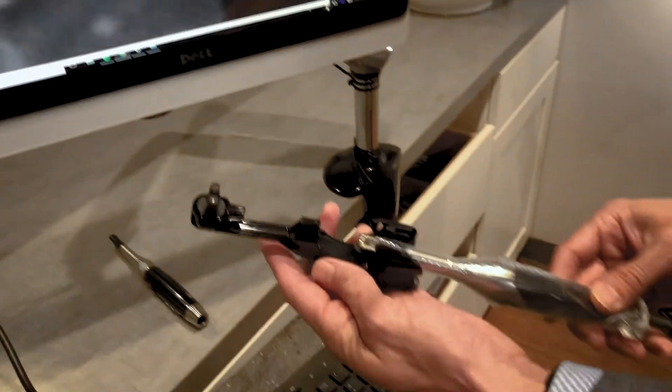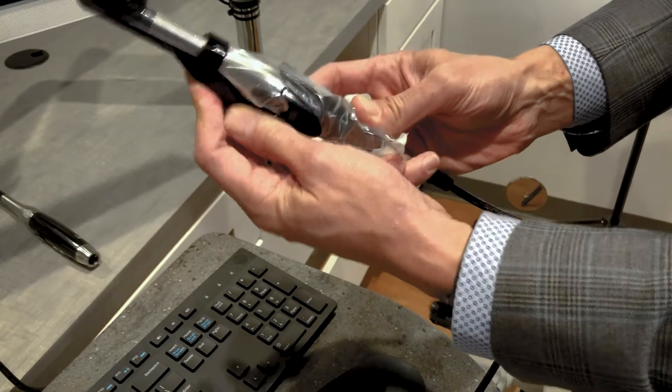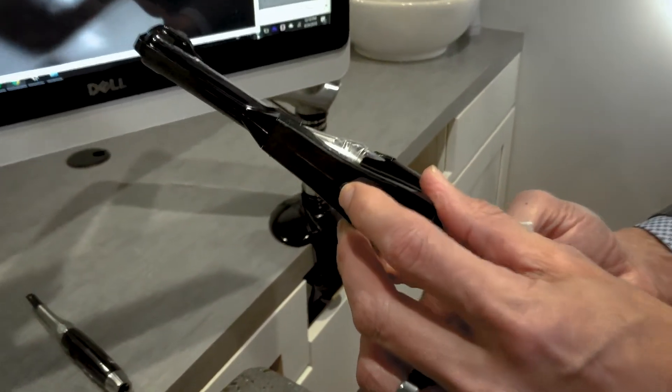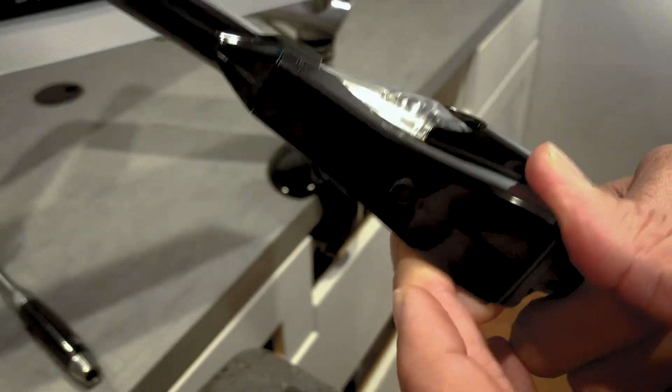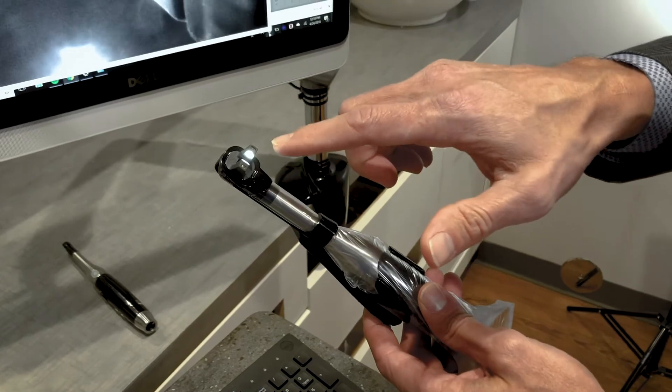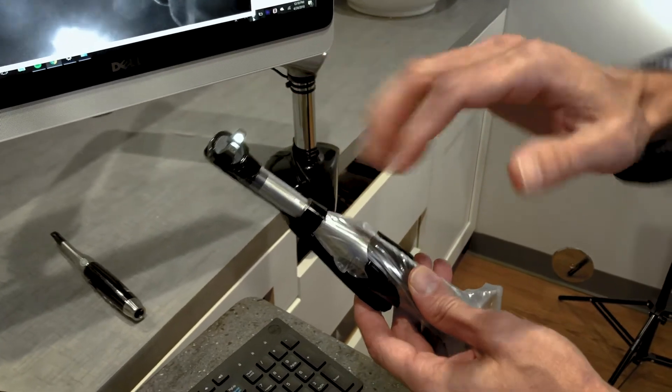Then you want to attach the Loom to the HD camera. On the back of the Loom right here, you have the power button. That power button will turn on the light on both sides. We're going to illuminate the tooth from both sides right here.